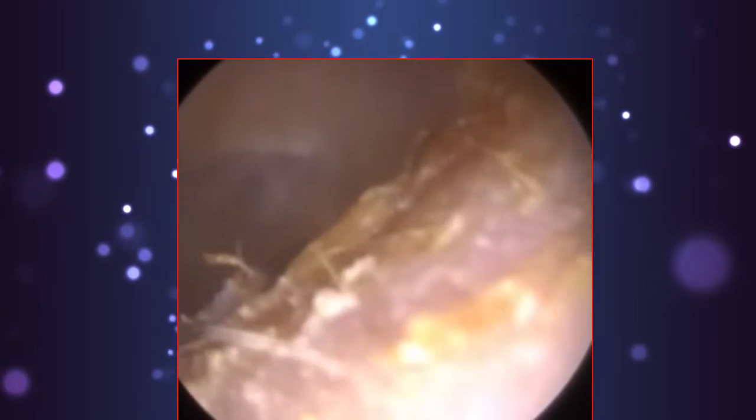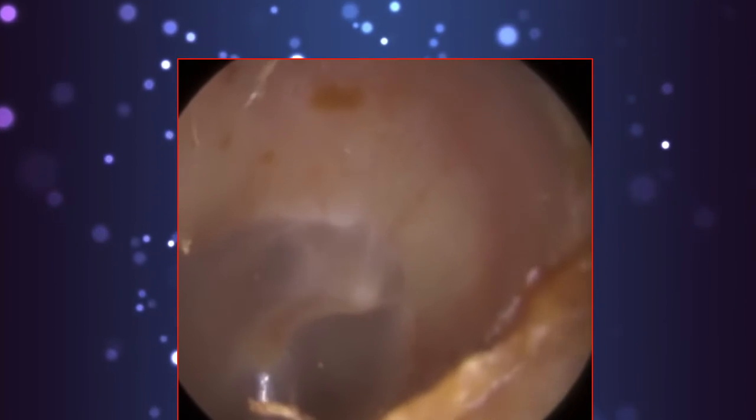So what I'm trying to do now for this patient is just peel as much dead skin off as I can. We're never going to get all this dead skin off. It's just near on impossible. So we're just trying our best. And to peel this dead skin, we are having to make contact with the canal wall. Laterally, it's on the cartilaginous portion of the ear canal, and we can apply a bit of pressure because that's cartilage. It's semi-sensitive. Doesn't mean that it's non-sensitive. If you're quite aggressive in the outer cartilaginous portion, it can still cause a bit of injury and trauma. It can be unpleasant for the patient.